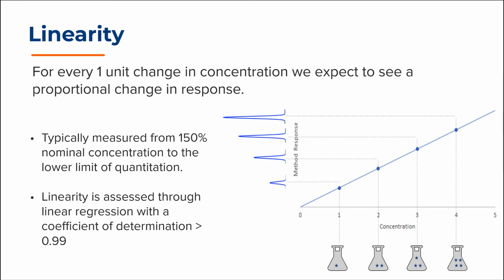That said, using traditional least squares regression analysis, a linear relationship can only be established over 3 to 4 orders of magnitude in concentration. Depending upon the unevenness of the variability in the measured response across the range of data, the data may need to be fit with a weighted linear regression. Additionally, one must consider the leverage of data points, especially at the upper end of the linear range. Leverage is a measure of how extreme values in the concentration will influence the regression results.